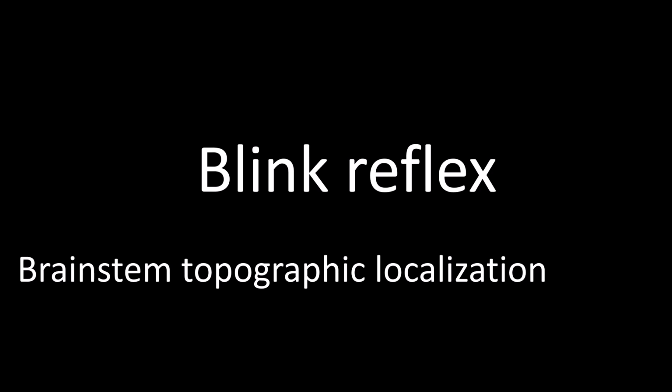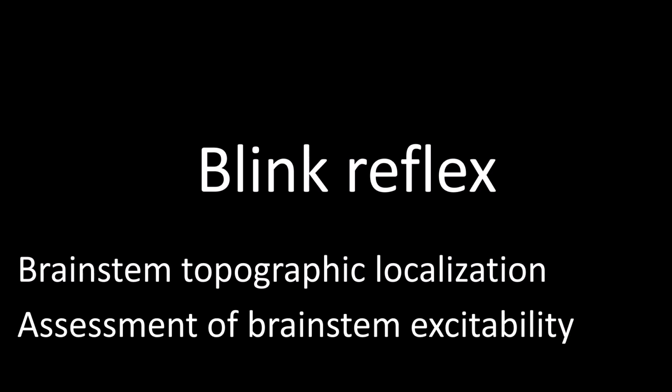This talk is about the blink reflex. This test is an electrical evoked event testing the trigeminal facial reflex. It is useful for topographic localization in the brainstem and assessment of brainstem excitability. During this talk, we will only address its use in brainstem topographic localization.